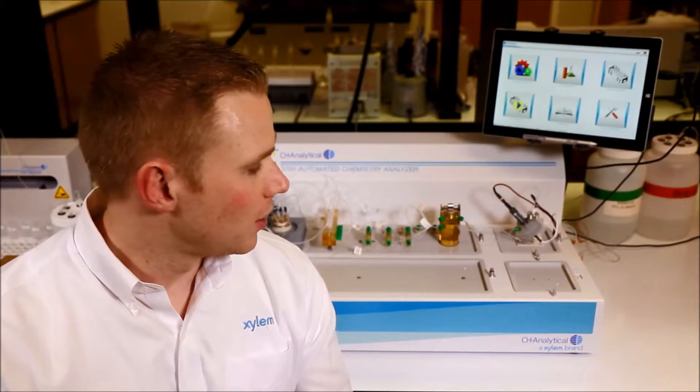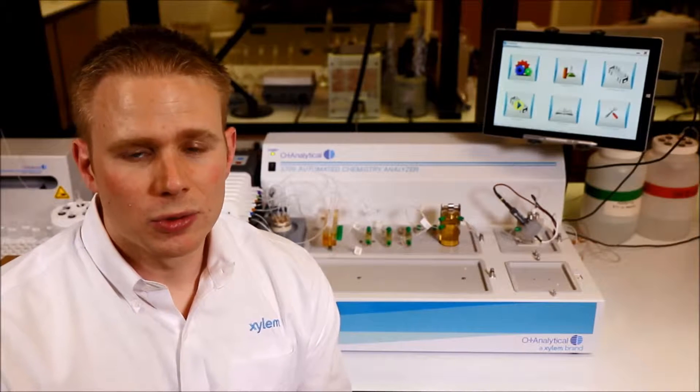OI has been really the leader in cyanide analysis for the last 20 years and this is our latest generation of instrument really designed to focus on user experience and making instrumentation like this simple to use.